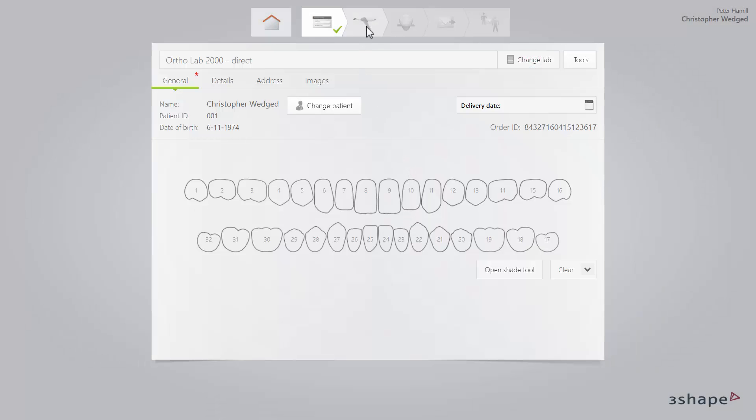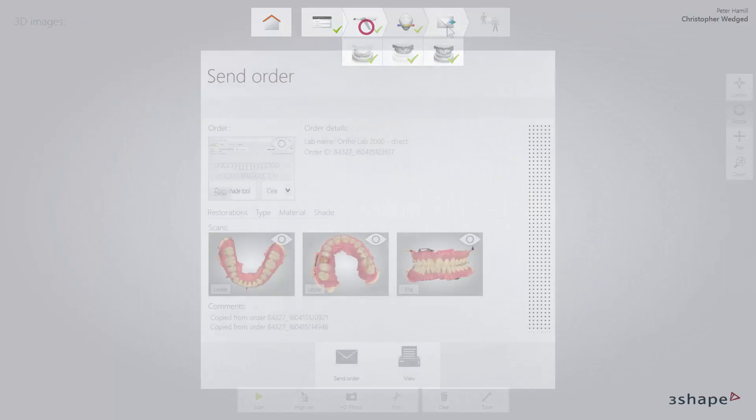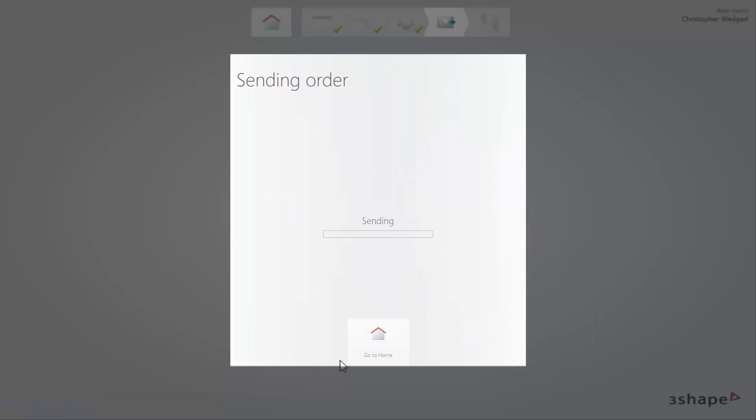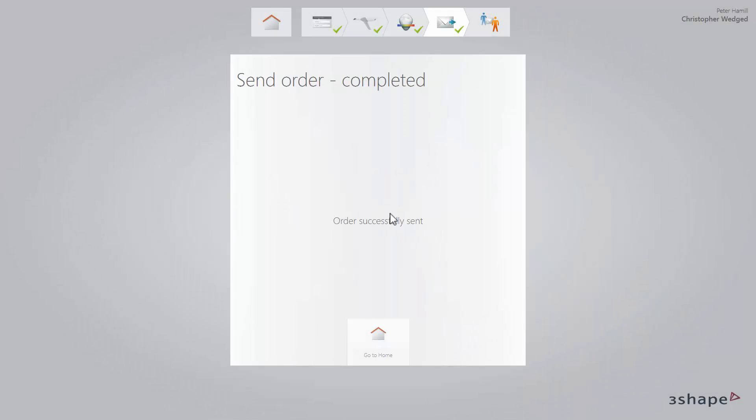Continue with the usual workflow, and while on the Send Order page, click the Send Order button. Then your order will be sent to the lab chosen beforehand on the Order Form page.